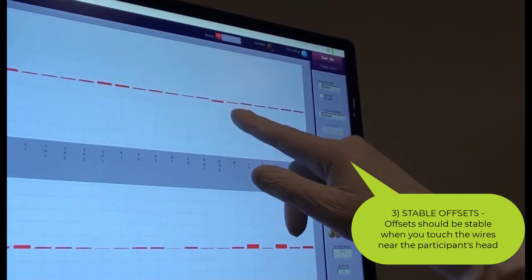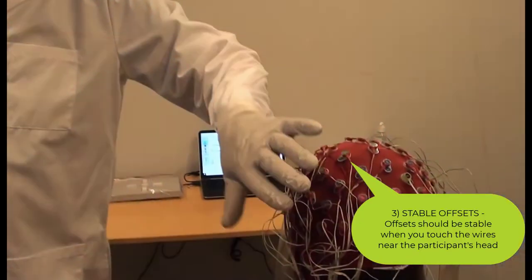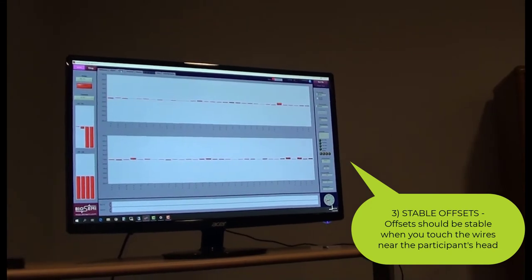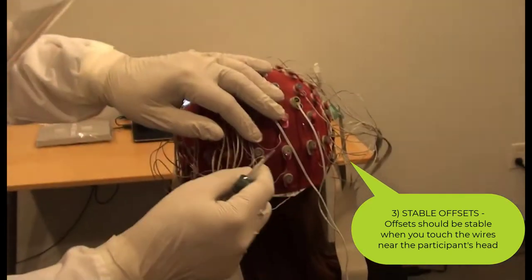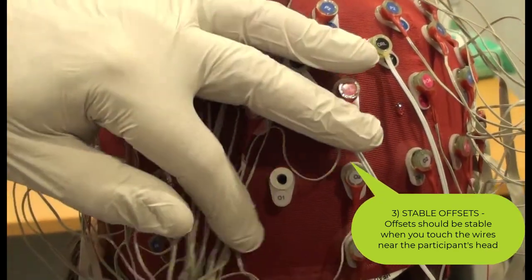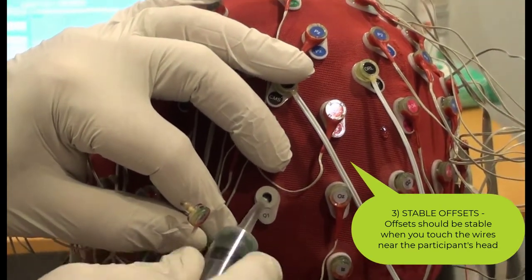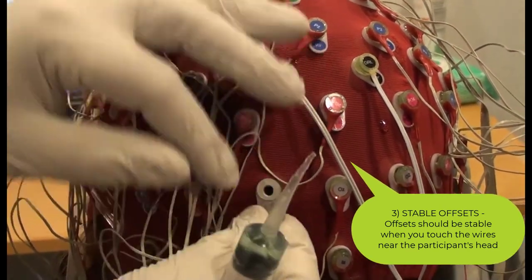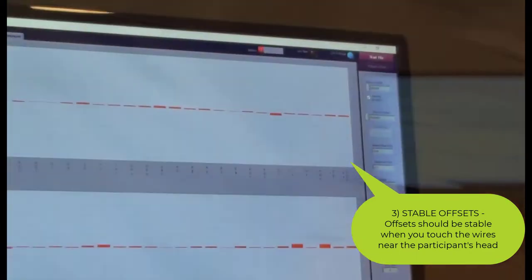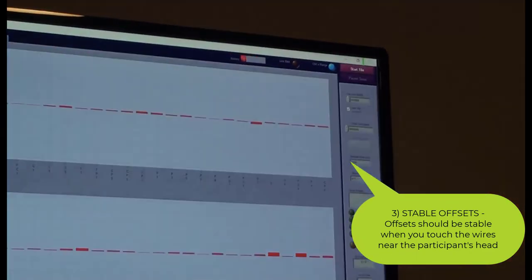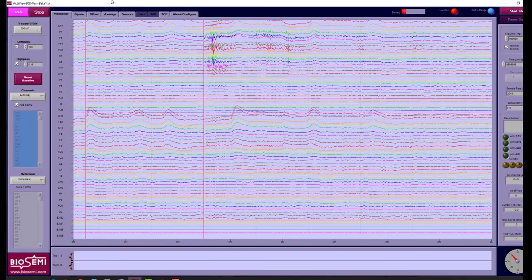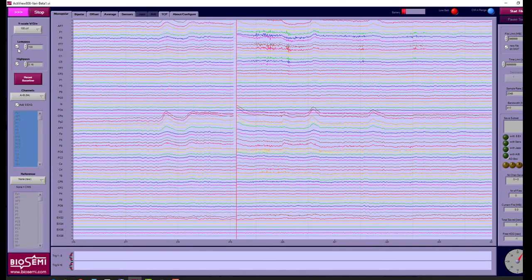Once all electrode offsets appear to be in range, look for unstable contacts. At a scale of 262 millivolts on the Offsets tab, the red bar should be quite stable when you touch the wires near the head. If you see any bars that appear to bounce or oscillate when you touch the wires, do the same process of removing, parting the hair, injecting gel, and reinserting the electrode at each of these sites.